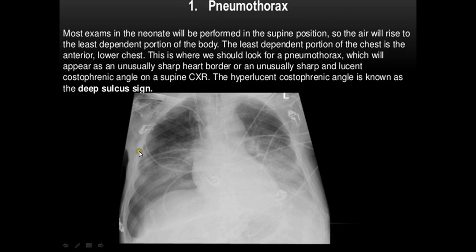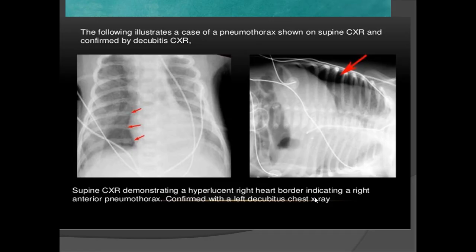Coming to chest emergencies: pneumothorax is the most important emergency routinely encountered. Here, the deep sulcus sign is evident — comparing left and right, the costophrenic angle on the right extends lower than on the left. This is pathognomonic for pneumothorax. In a supine patient, free air accumulates along the cardiophrenic angle, displacing the lung laterally while air collects medially.